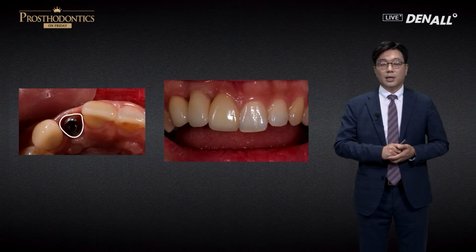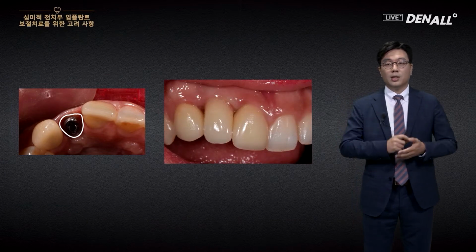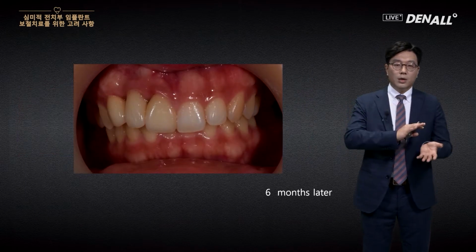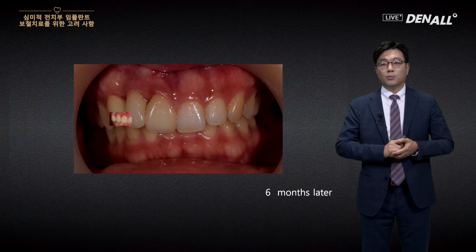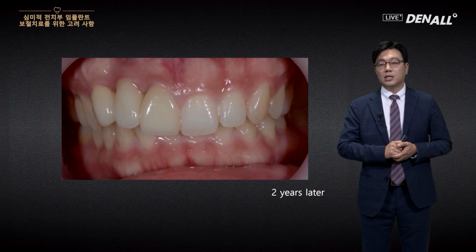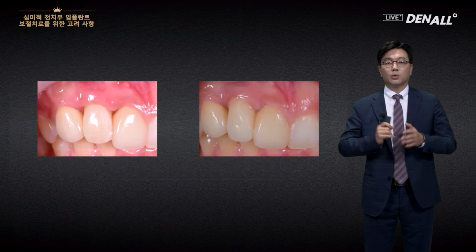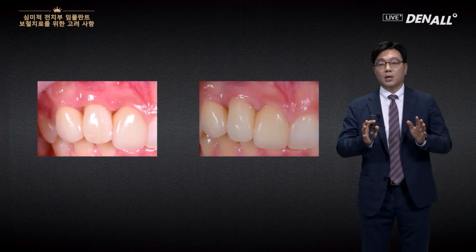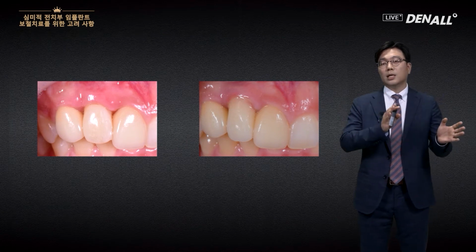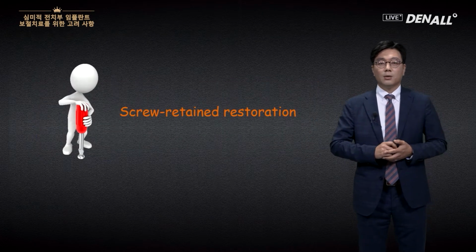If you look at here, the gingiva is pressed down. Then it becomes like this. When the gingiva is pressed down, the surgical approach could not resolve the problem, but the papilla is pushed out prosthetically. So prosthetically, we can help resolve the problem in terms of the pink aesthetics, not white aesthetics. So there is a way for prosthetics to resolve certain problems.